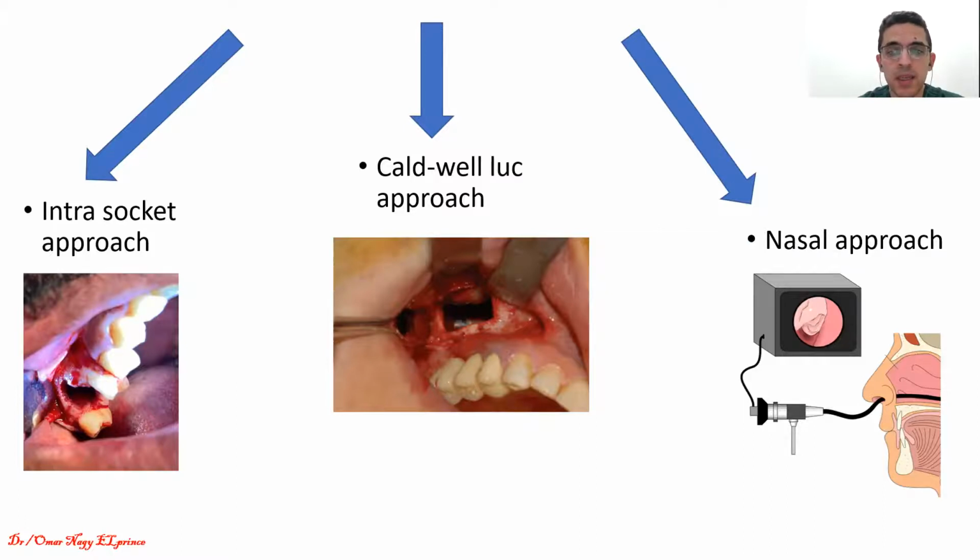That means you don't expect that you will retrieve an implant by your naked eyes through a nose. You will never do this, unless the implant is displaced to the nose, which we will discuss later. بس هو في أغلب الأحيان لو إحنا هنستخدم nasal approach, we have إن إحنا to use the endoscope.